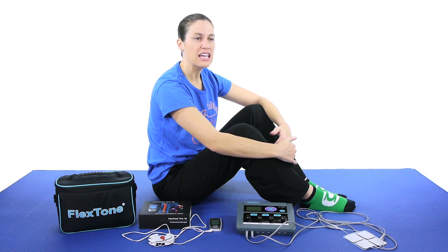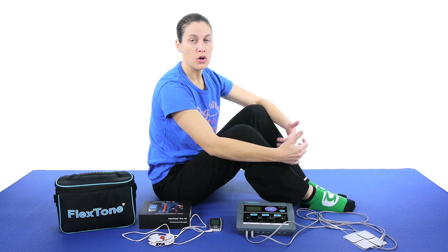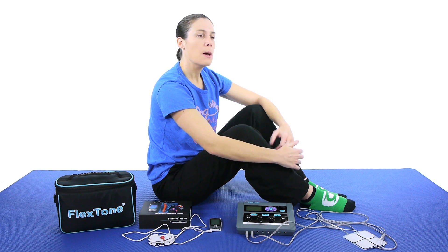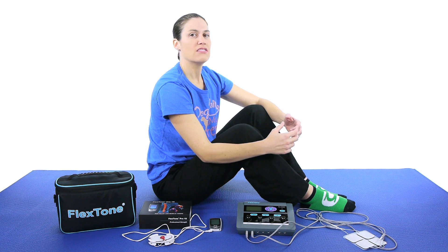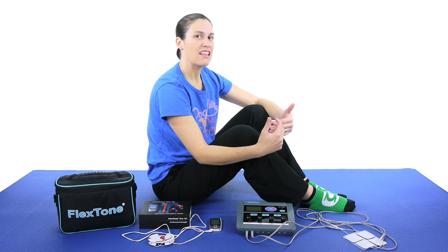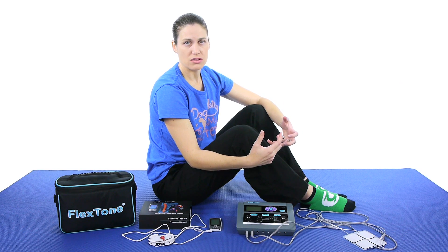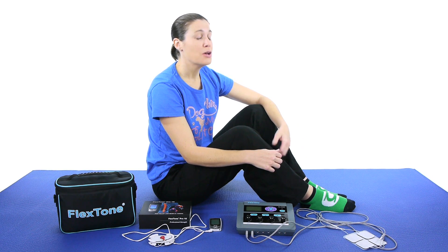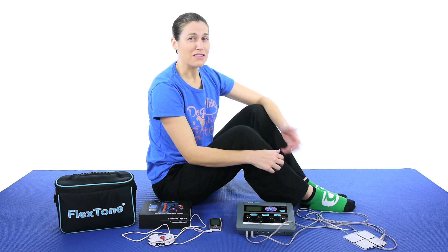The TENS to me has this vibration feel, which is really comfortable. Some people aren't a huge fan, but basically in simple terms, what it does is that vibration follows the same pathway as the pain pathway, so it kind of cancels it out. So then that pain that you're feeling doesn't go up to the brain — that vibration goes up to the brain. So I always call it a little bit of a massage kind of feeling, and massages are always comfortable.